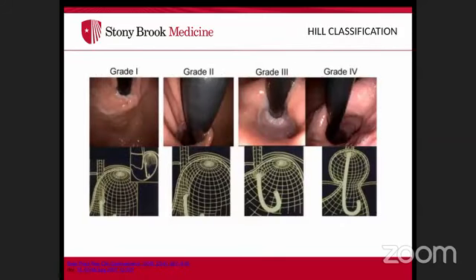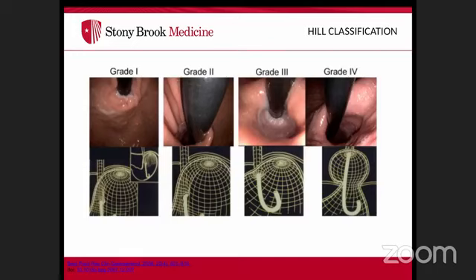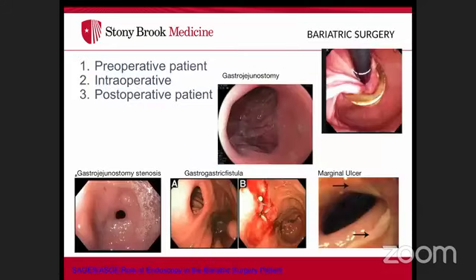Grade two shows a less prominent fold that intermittently opens and closes around the scope. Grade three shows almost no fold but still visible columnar epithelium. Grade four is completely open and highly correlated with hiatal hernia — the esophageal lining is visible from the retroflexed position.